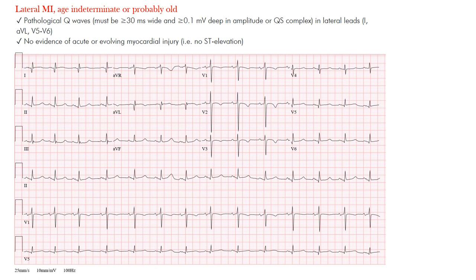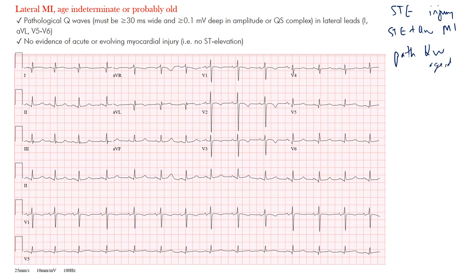So lateral MI — age indeterminate or probably old. Not the acute injury pattern or infarct pattern where we see elevation of the ST segment. In this case, we're looking for pathological Q waves. Remember, if you have ST elevation only, this is more of that injury pattern. If you have ST elevation plus pathological Q waves, we call that the infarction pattern. And if you just have these Q waves, this is where we call it age indeterminate. So three different patterns — this is the one we're looking at.